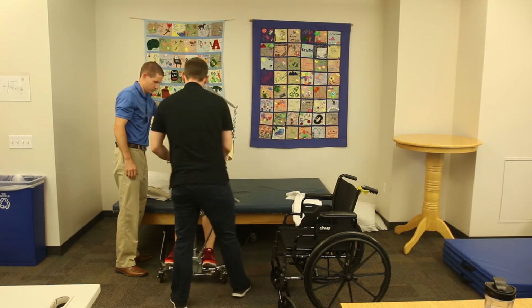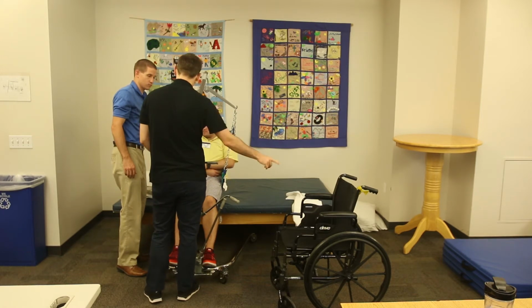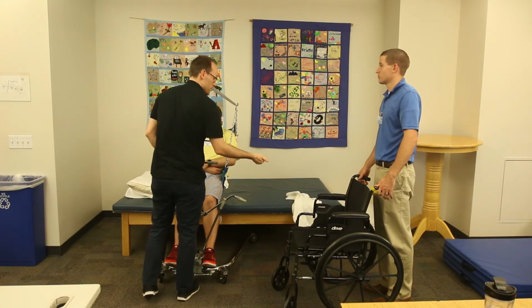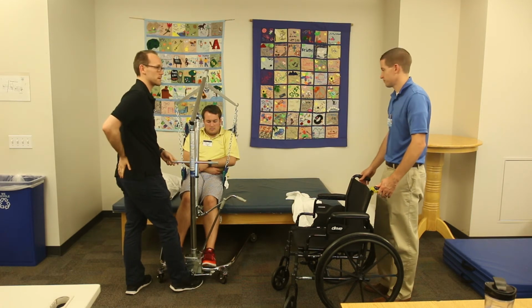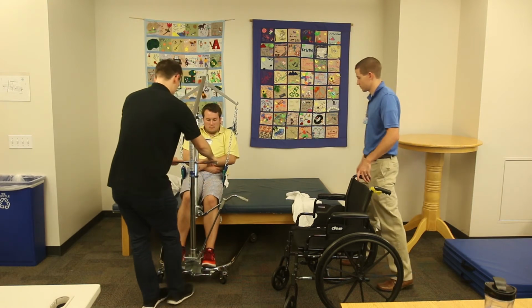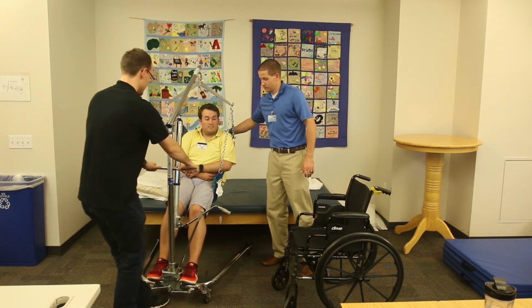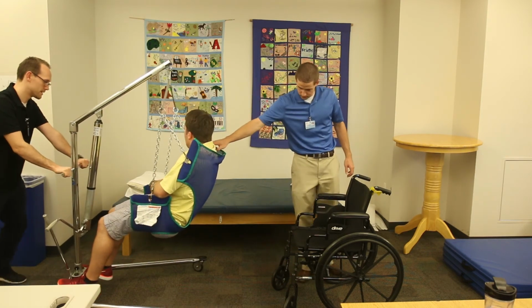Great. All right, Dylan, I want you to come over here at the chair, and you can help position the chair there. I want you to tip the chair while we're lowering him, and then I want you to hold the back of the Hoyer so his hips come back to the wheelchair. Okay. You can unlock this. Doing okay, Richard? Yeah, this is fun. Great.